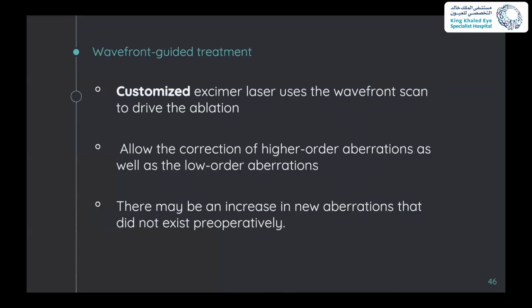But one point here is very important to mention: the wavefront scan is actually generated from the whole optical system aberration. What we mean by this is that it will take the cornea and lens aberration into consideration whenever they treat by this profile.